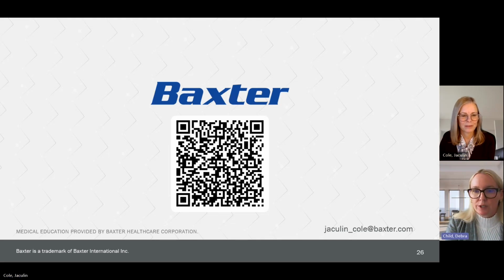Sure, absolutely. Syringe pump manufacturers include metrics from each of the syringes that are characterized, and those are included in the pump. As the syringe is loaded into the pump, there are typically several sensors on any syringe pump that will assess the external barrel diameter and some other features. That is how the syringe pump will detect the size of the syringe.